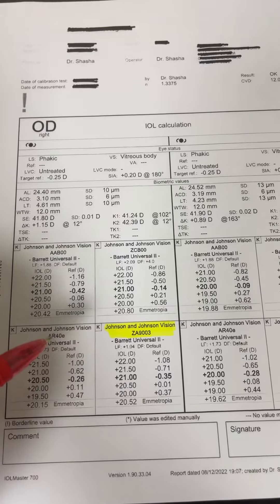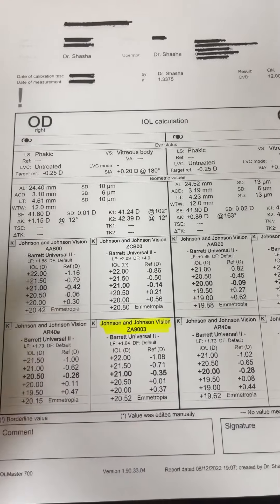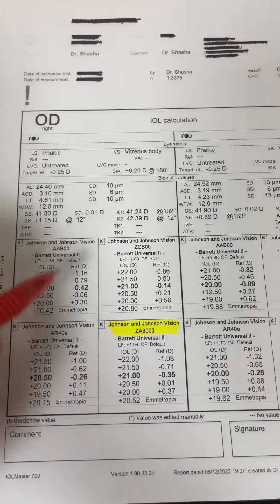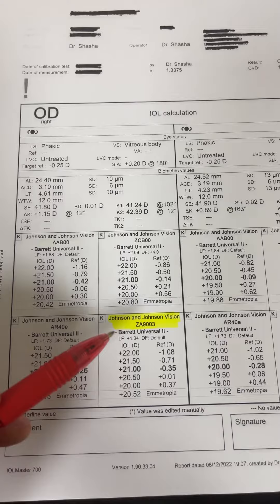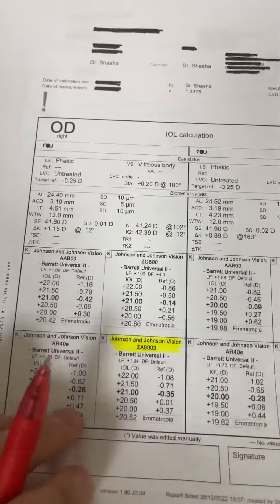When seeing a patient for a dislocated IOL, it's important that you have the relevant lenses for secondary IOL fixation. In my printout, I always have the ZA9003. I use this for the Imani technique, as well as for optic capture and modified optic capture.